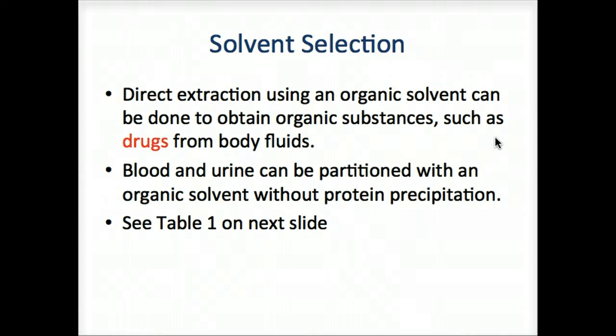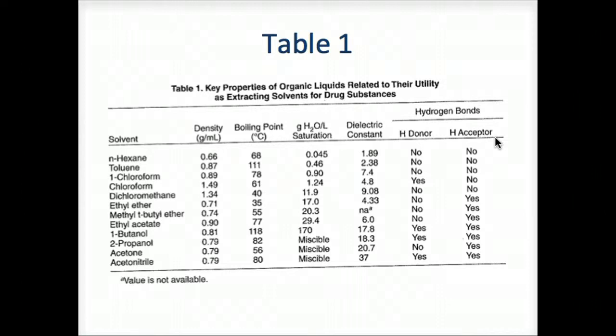Table 1 on the next slide shows extraction-related properties of solvents that have been used in forensic toxicology. You can see solvent polarity is very important when selecting a solvent for extraction. All drugs today have some degree of polarity. Table 1 shows polarity in two ways.